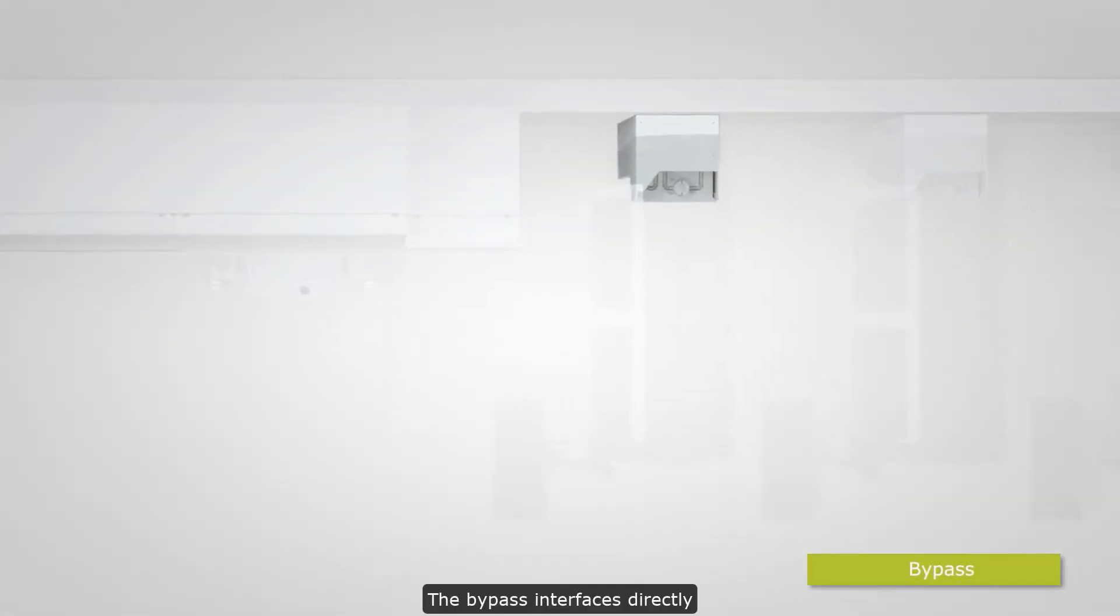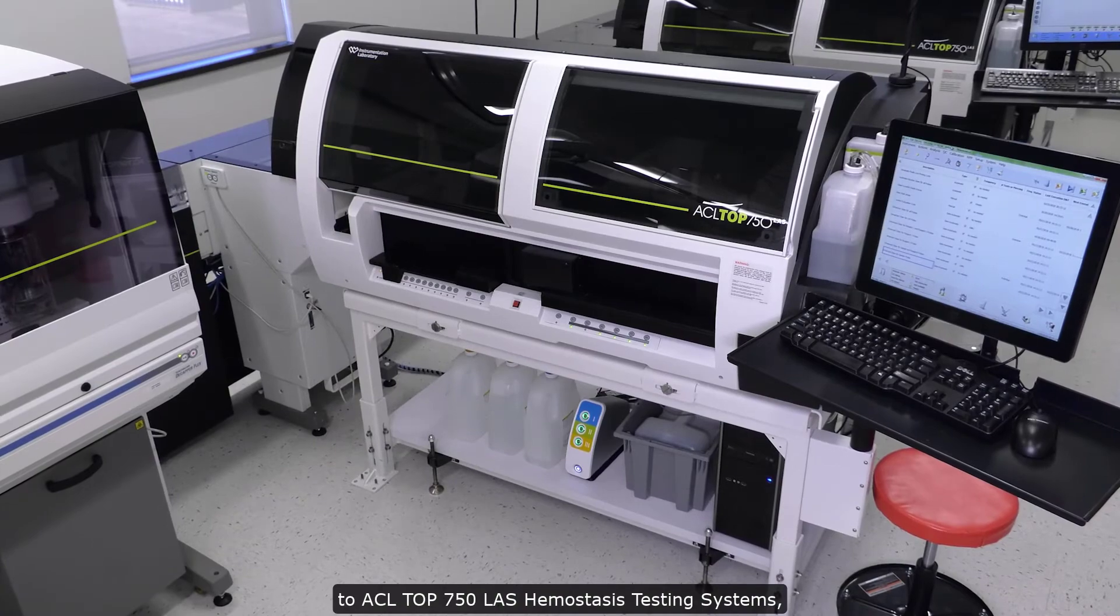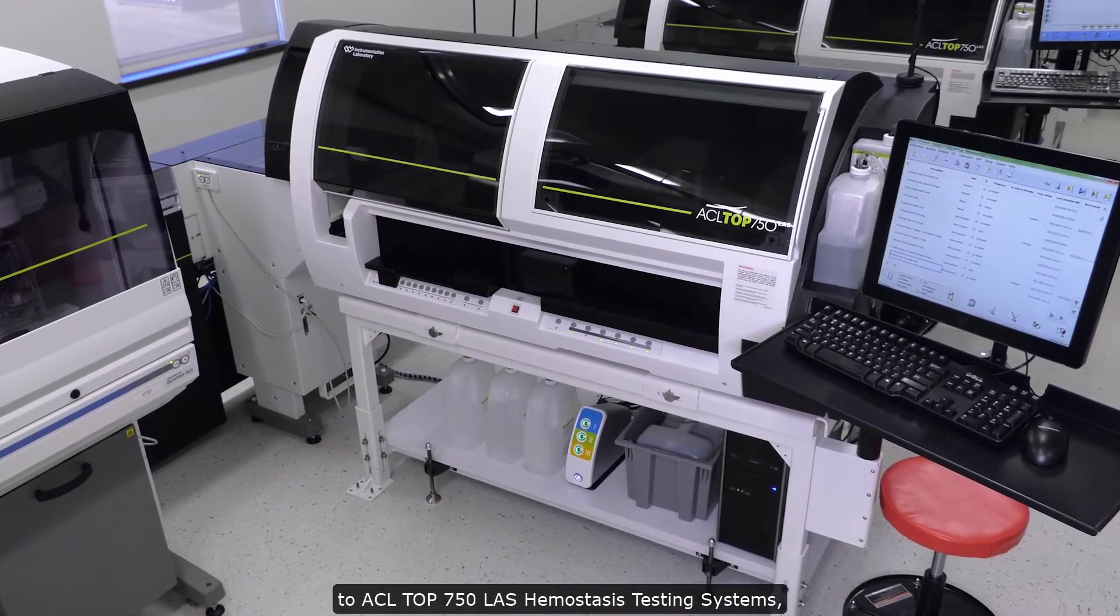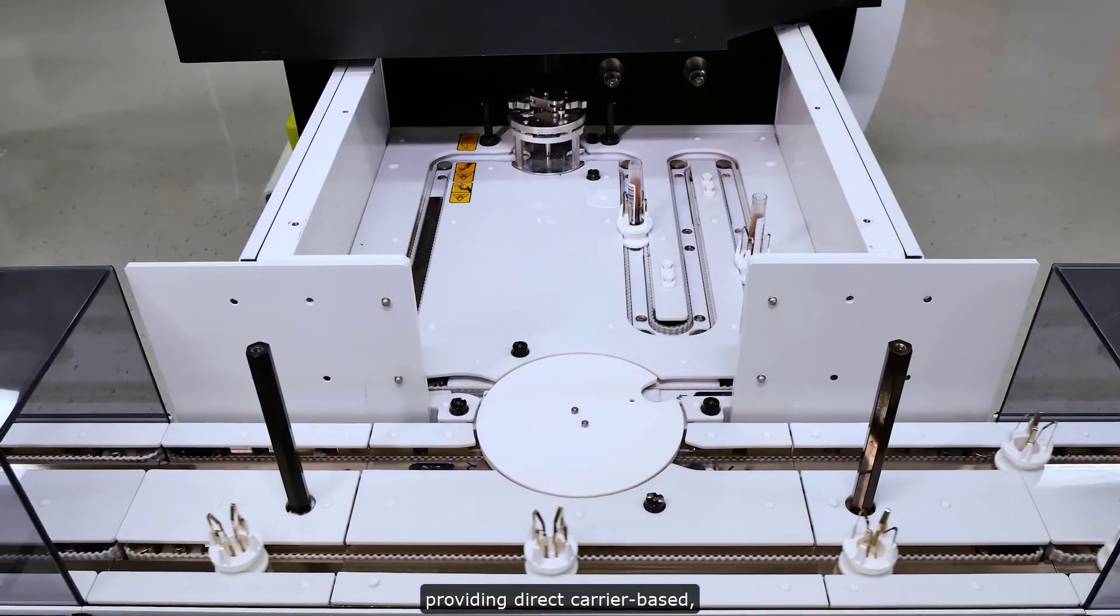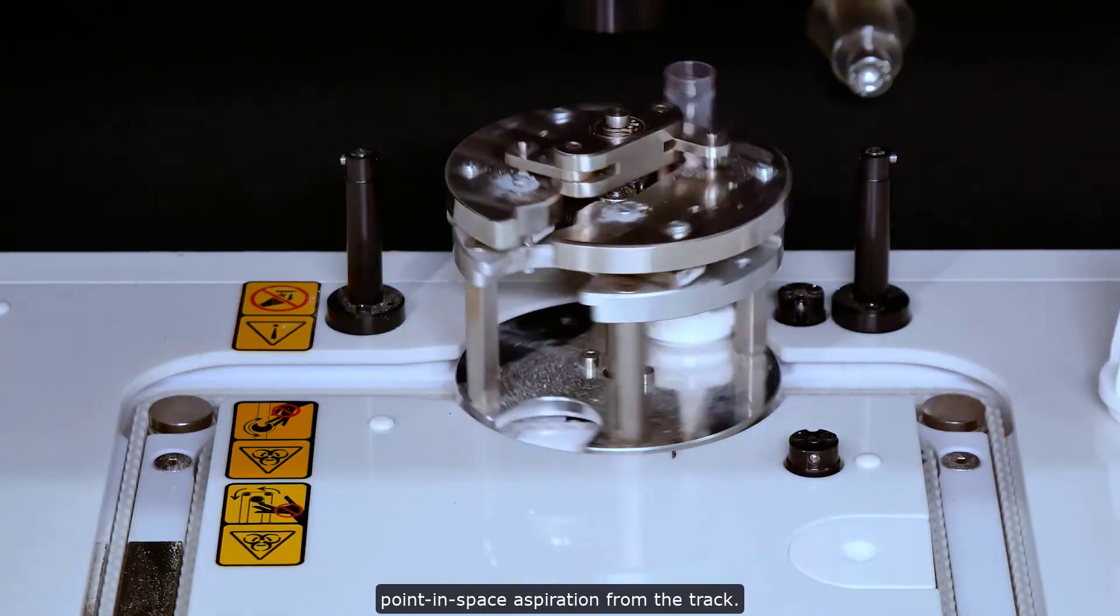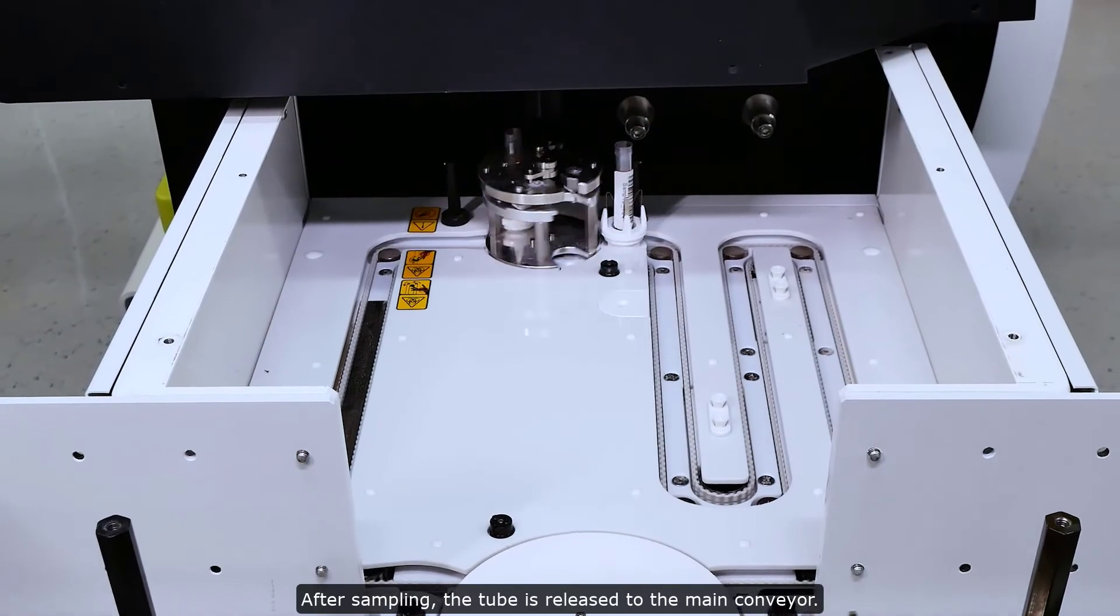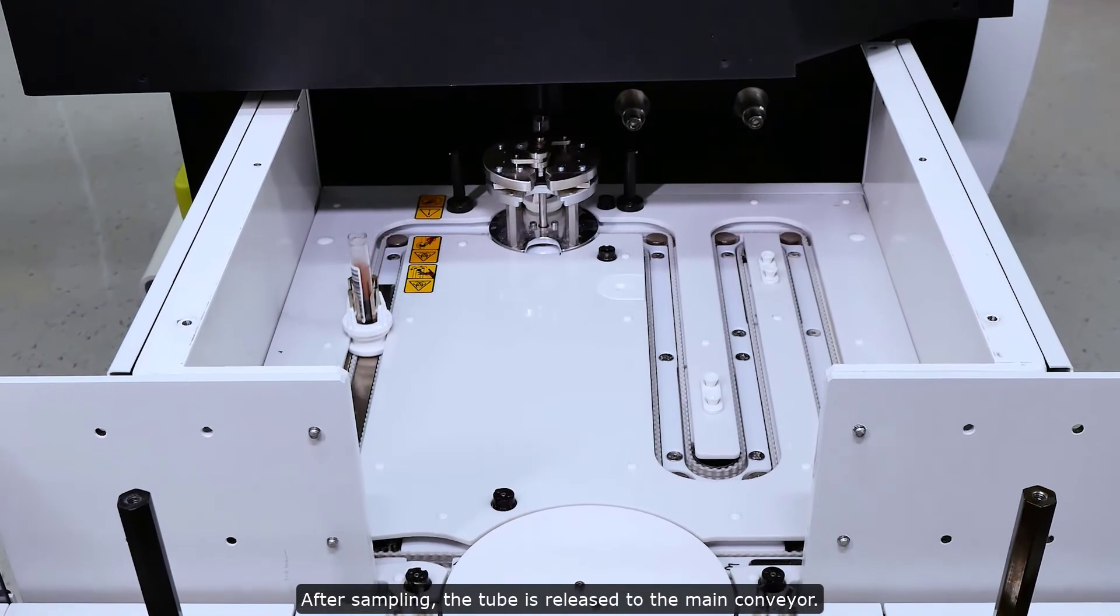The bypass interfaces directly to ACL Top 750 LAS hemostasis testing systems, providing direct carrier-based, point-in-space aspiration from the track. After sampling, the tube is released to the main conveyor.